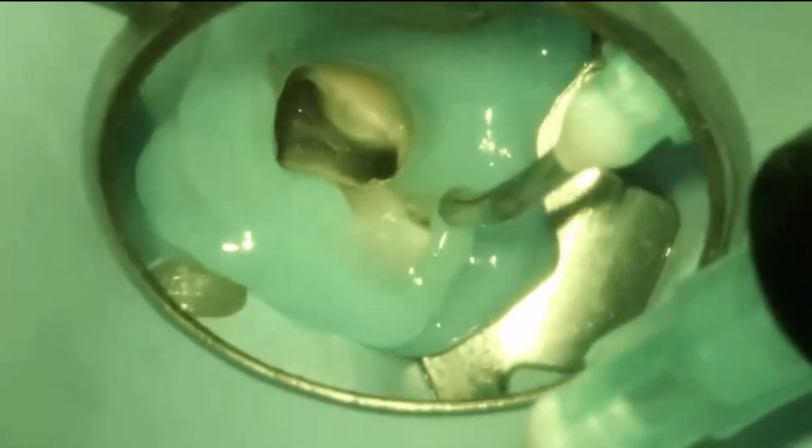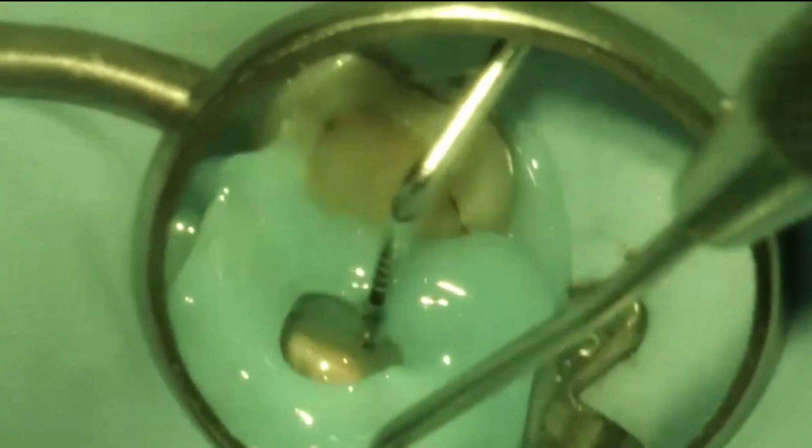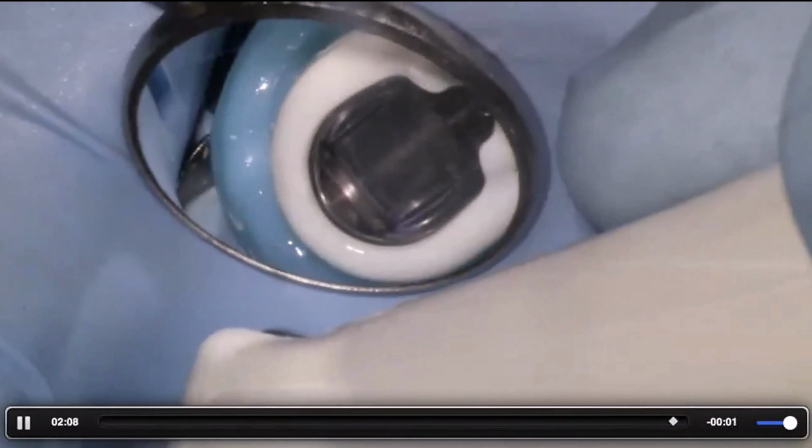And as I'm adding more, it's just becoming pretty much like a classic buildup now, right? And again, I'll just round that off. So you see, we're just rounding that off. And then we're ready to seat the matrix. Polymerize. See, I did some indirect polymerization there. Take off the matrix, clean it up, and then we're ready to go. And you can see we get a seal right away. See the line there.